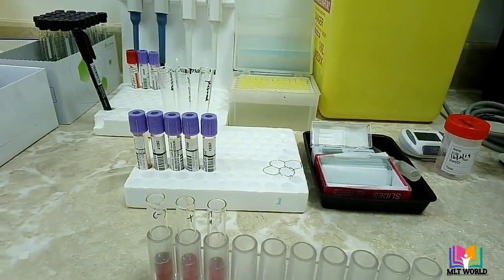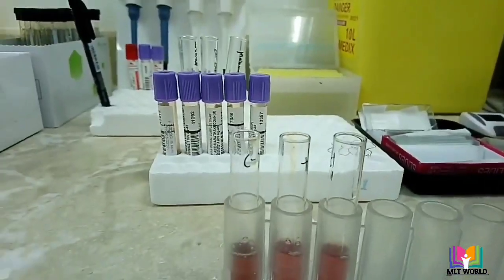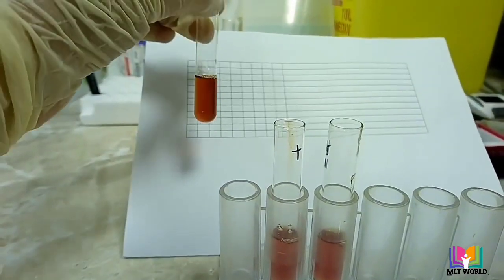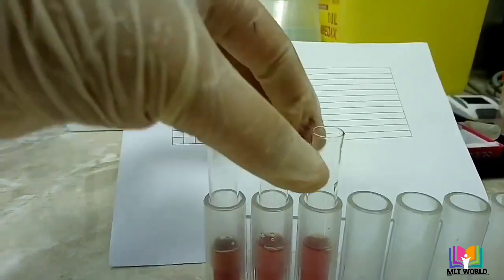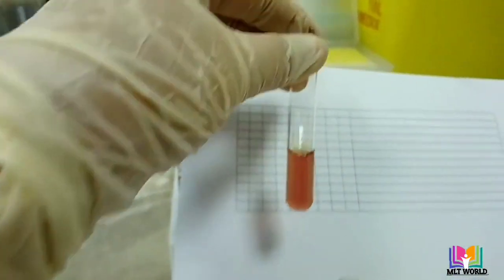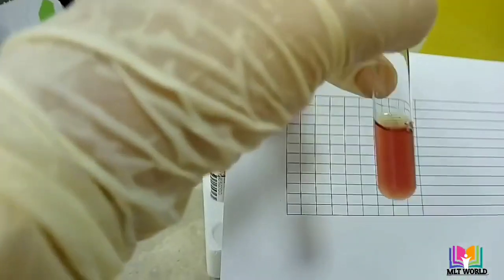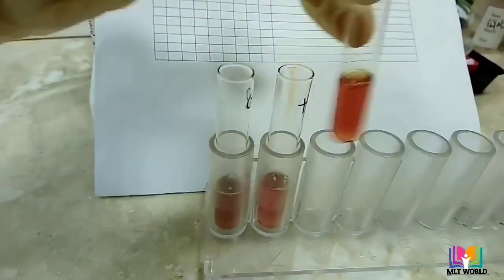The sickling test is reported as simply negative or positive. For more details, we will perform HB electrophoresis, which will tell us the percentage of sickle cells present in the body. We use this paper to read and record the results of positive control, negative control, and patient sample.